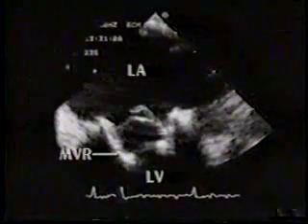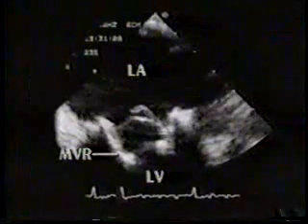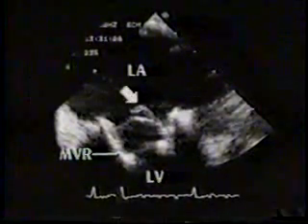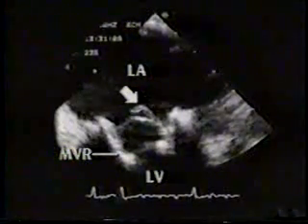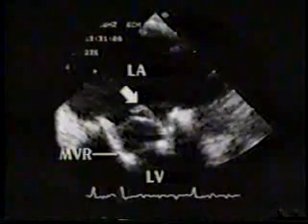The patient's mitral prosthesis was replaced. Prior to replacement, intraoperative transesophageal echocardiography demonstrated the torn cusp. In real time, you will see this vibrate, and you can imagine it producing the angry bee murmur.